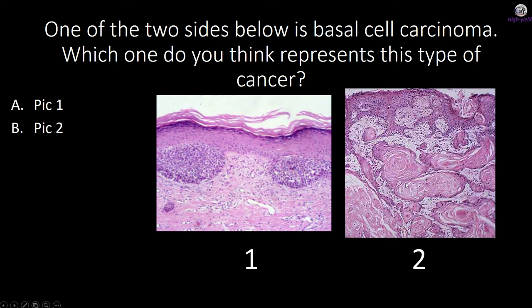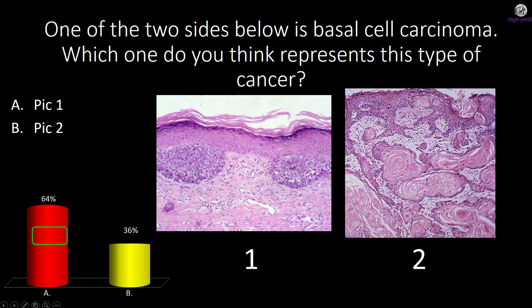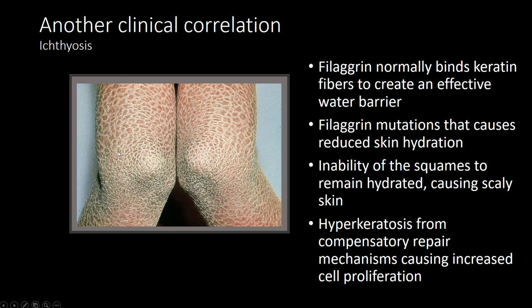I don't think that these cells are part of the basal layer. So I'm going to go with 1 for that. Awesome. I meant to say squamous cell carcinoma. So these are the characteristics, and you're going to go over this with an actual clinician tomorrow, these patches of keratin. And so you'll see that more in depth tomorrow.